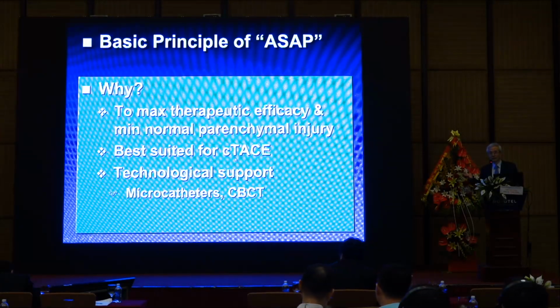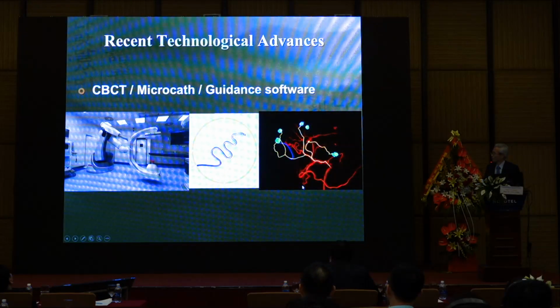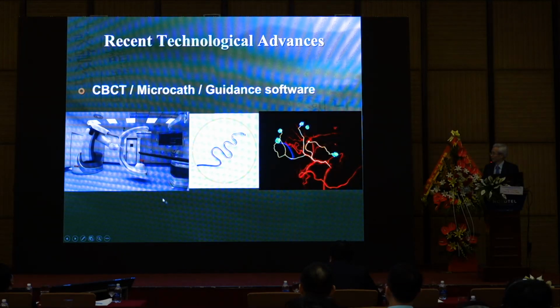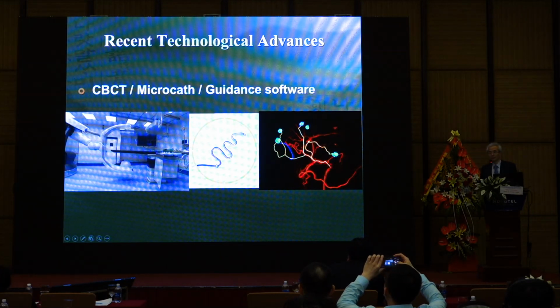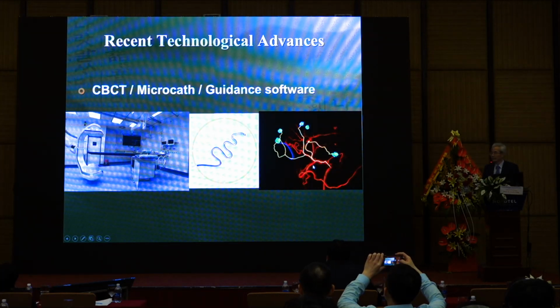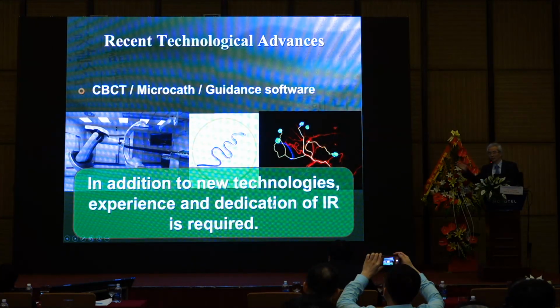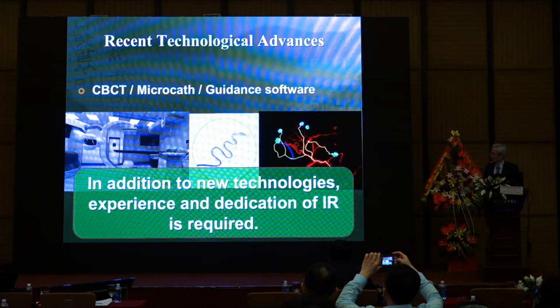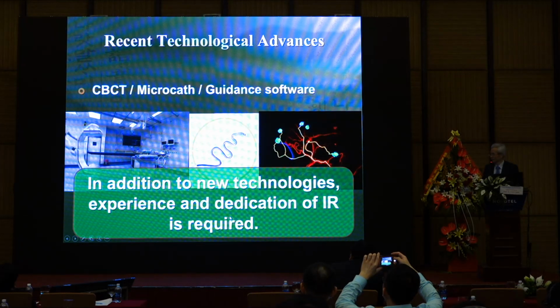Among competing modalities, actually it is best suited for conventional TACE. Now we have technical support such as microcatheters and cone beam CT. Nowadays we have good technologies, cone beam CT machines, very low profile microcatheters, and also intelligent guidance software. However, even if you have all these technologies, additionally the experience and dedication of the interventional radiologist is required.